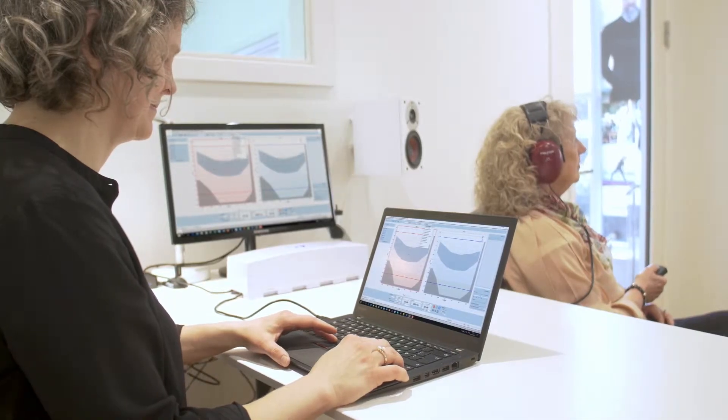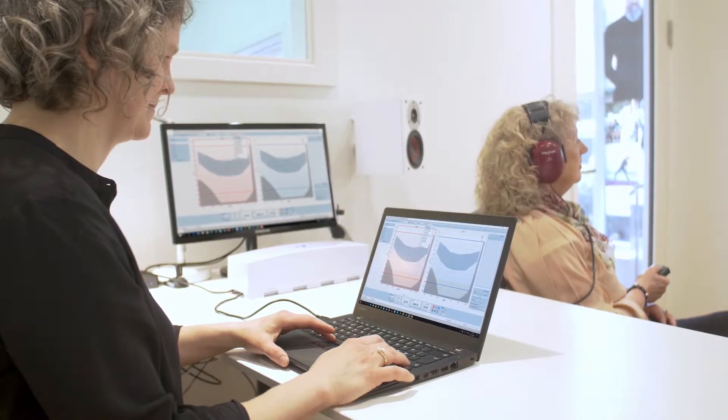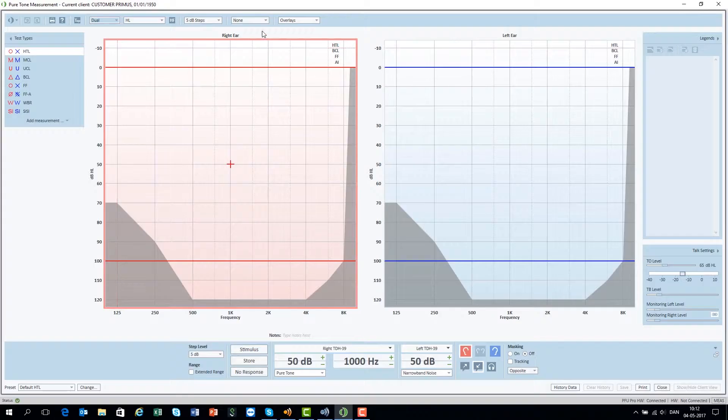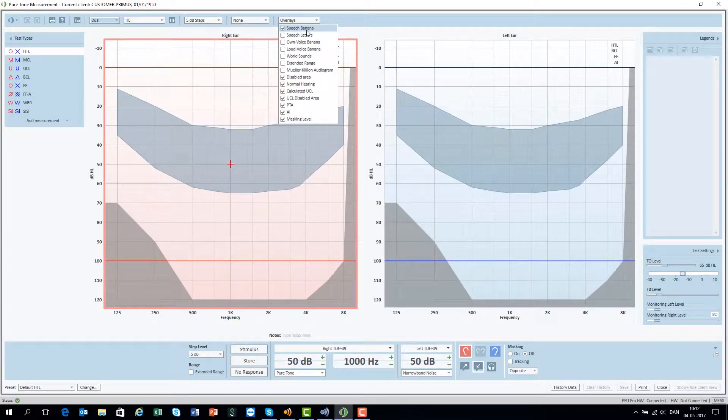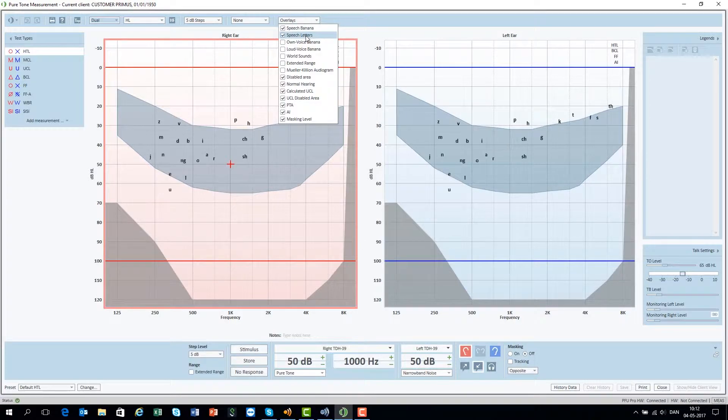Useful overlays help explain the audiogram for the client, such as Speech Banana and Speech Letters, which can easily be activated.